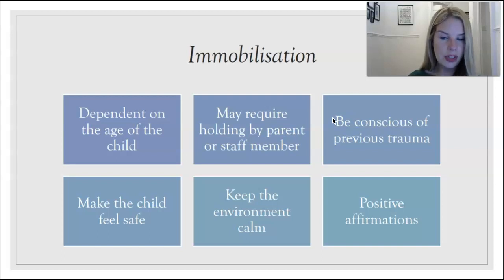But that's when we have to start really thinking about the impact that's having on the child. So if it's for a very short period of time and the child seems okay with it, then that's fine. If it's for a longer period of time and the child is getting really worked up and upset, then we have to really start thinking about the impact we're having on them mentally. We have to be aware of previous trauma they might have been through, especially if we're doing, for example, a skeletal survey because they suspect physical abuse. Well, if we're holding a patient down for a period of time, that could be very triggering to them if it's something that unfortunately they've experienced at home.